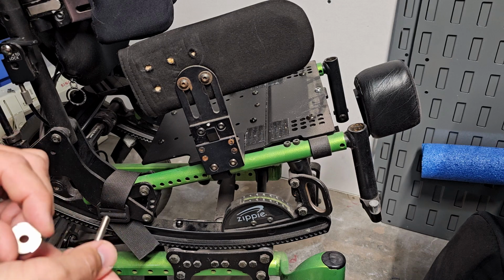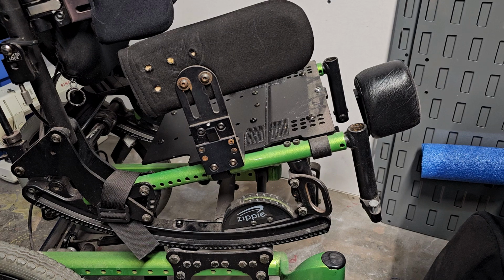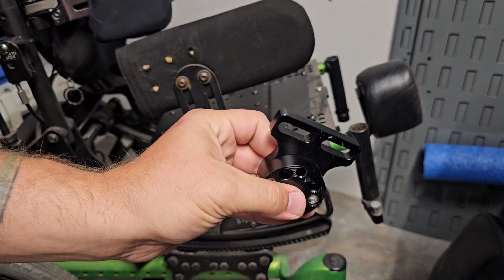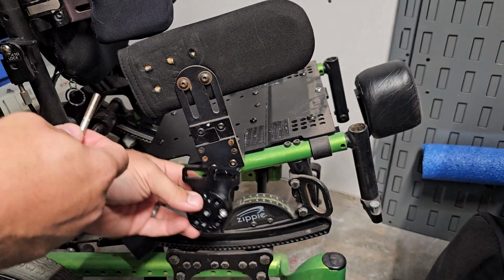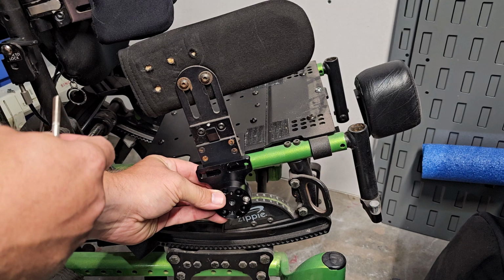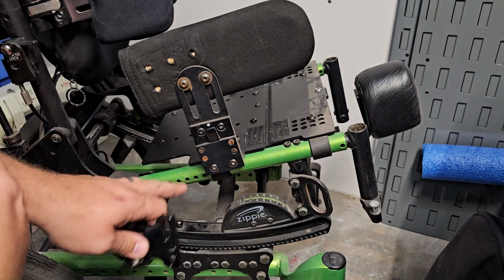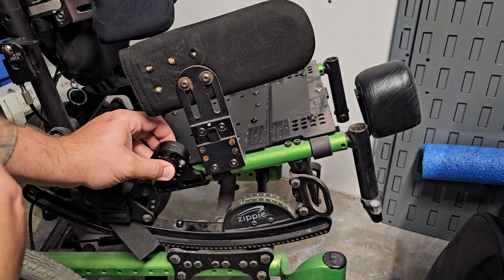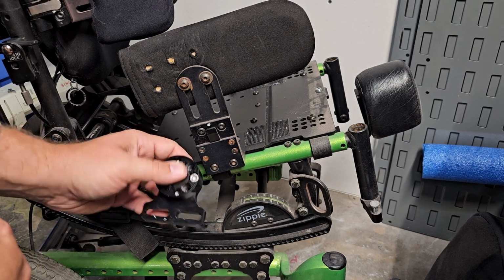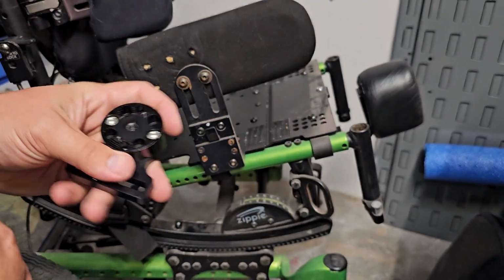But I will go through a couple things. So this first mounting bracket that you get, this one here. Now this one, I see people usually mount here or on the sidebar or down here. This is getting to be pretty low. You can go upside down. These brackets can be mounted either which way as long as the grooves and holes are facing outward.